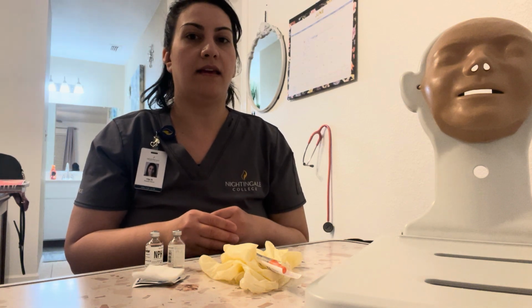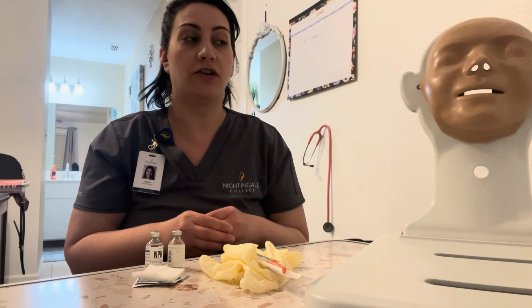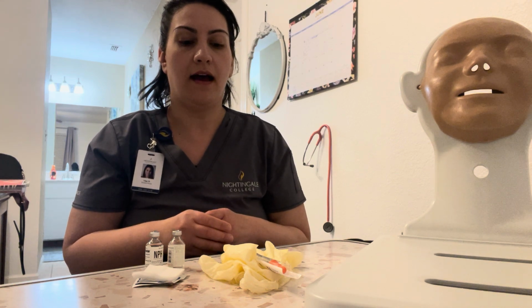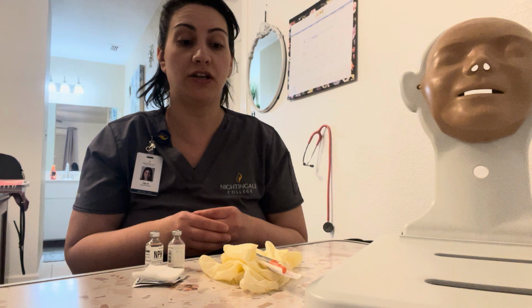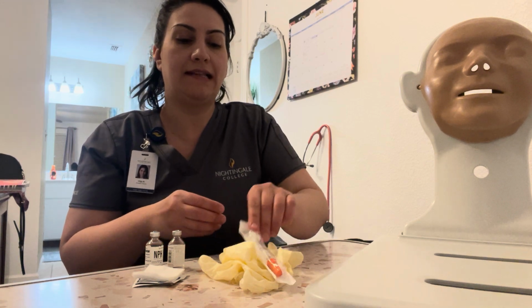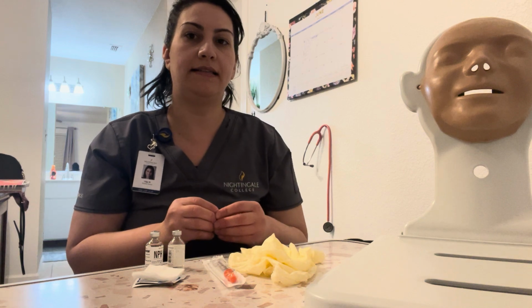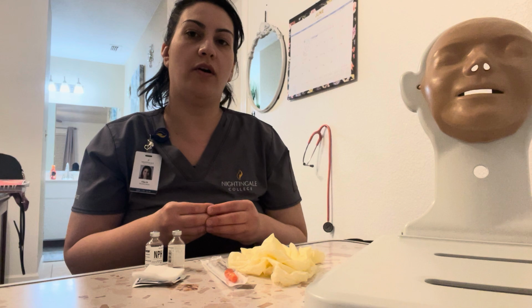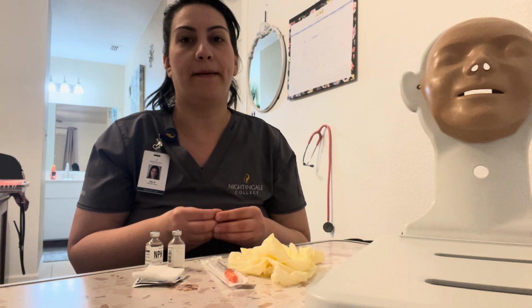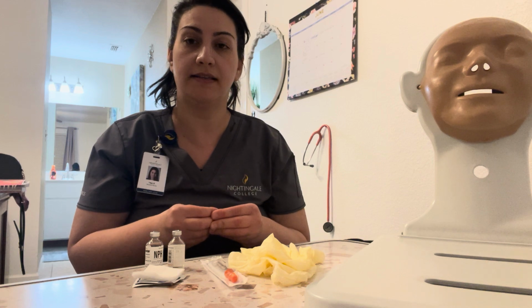So, Mrs. Smith, you're going to get insulin. Your doctor has prescribed you insulin. There's going to be 2 medication vials that you're going to be receiving in 1 injection. You're going to be receiving regular insulin and intermediate insulin. I will go over the mechanisms of them, side effects and adverse reactions.